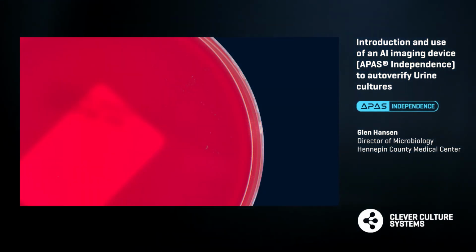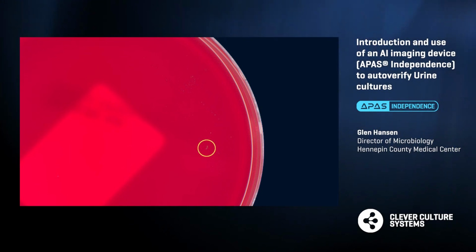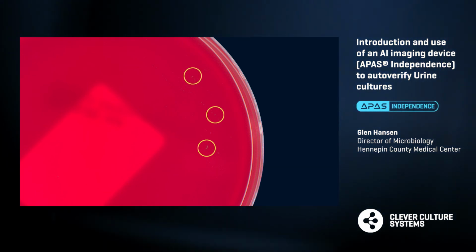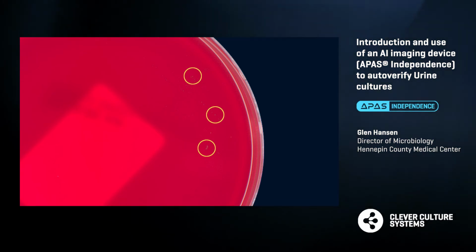And this is a slide just showing you what we can see. This is really difficult to see, but you can see the significance, or the lack thereof, of this disconnect that we saw in minor amounts between the tech reads and the APAS. Within each yellow circle is a small colony of alpha strep. And as mentioned before, these are very rarely ever reported as significant in our lab. So I wanted to show you this image so you could put in context what we were seeing with some of the disconnect.